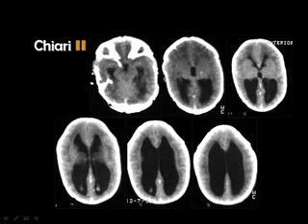This is the appearance of Chiari. In this case, you can see that the third ventricle is slightly dilated, the lateral ventricles are dilated, and the fourth ventricle is not seen, it is markedly attenuated. Then anyone may think about aqueductal stenosis, where the fourth ventricle is attenuated and the third ventricle as well as the lateral ventricles are dilated.